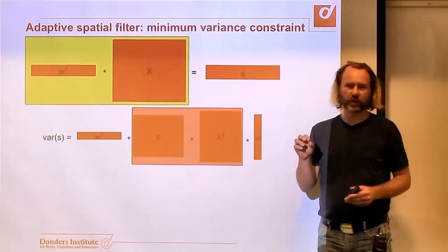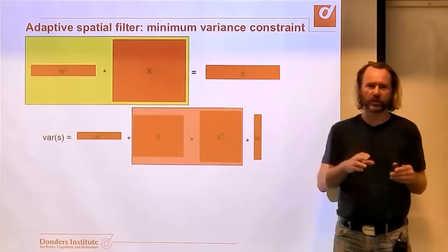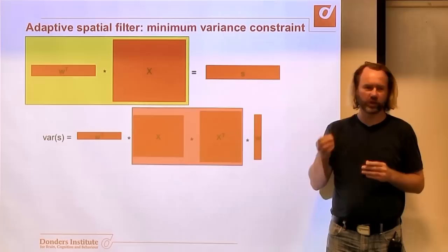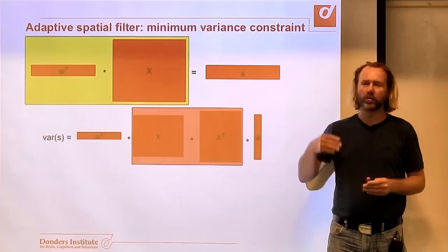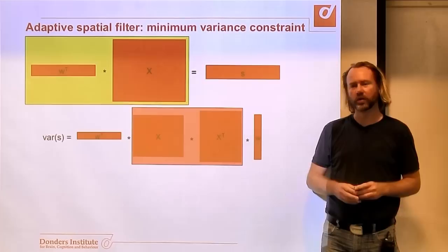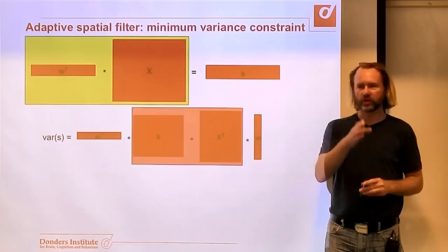So if you first make a proper statistical contrast at the channel level, then you've addressed the question: is there a significant difference between these conditions? And if you've done that correctly, then you know that there's a significant difference. Then you're only using the beamformer to find out where that difference is located in the brain. So at the level of the beamformer, you don't care about statistics anymore, because you have already done your statistical inference at the channel level. But that depends on the research question.